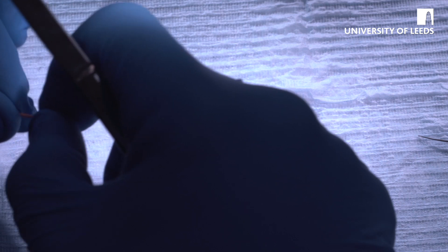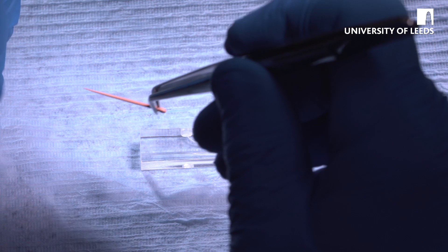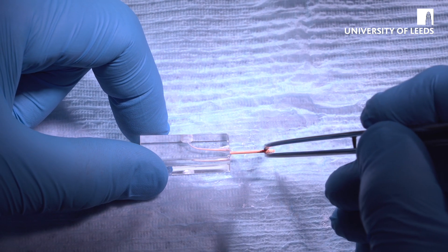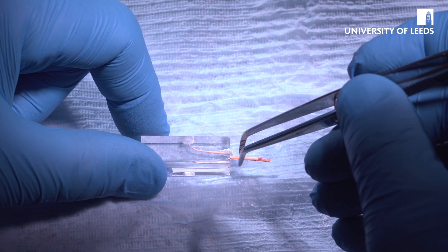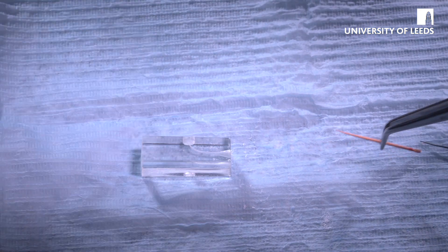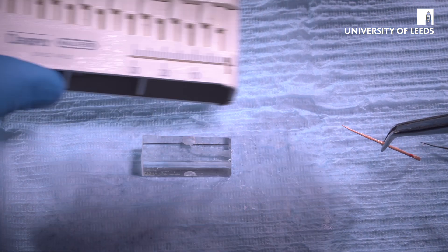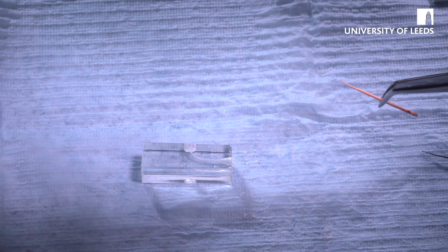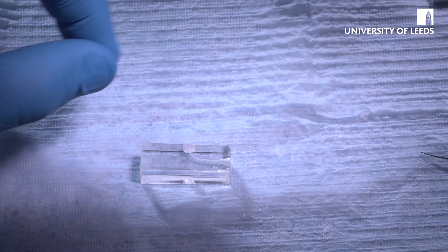So we're going to use the match cones from the ProTaper system — we've got an F2 match cone here. If you've used WaveOne, there are similar match cones which are actually the same geometry. We're going to try that in with the canal still having some irrigant in it, just to allow it to slip to length. We know that it goes to length — pinch it there, take it out again, use our endo measuring block and check that it's going to length, which it does. Next step is to dry the canal.